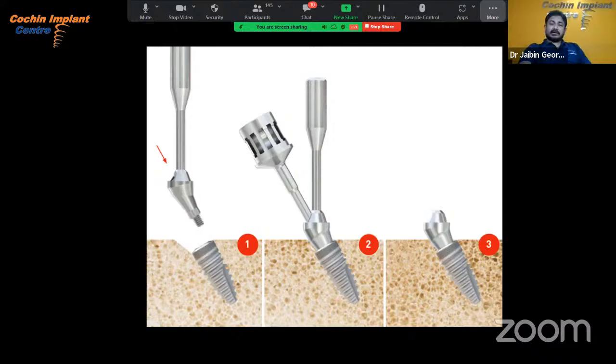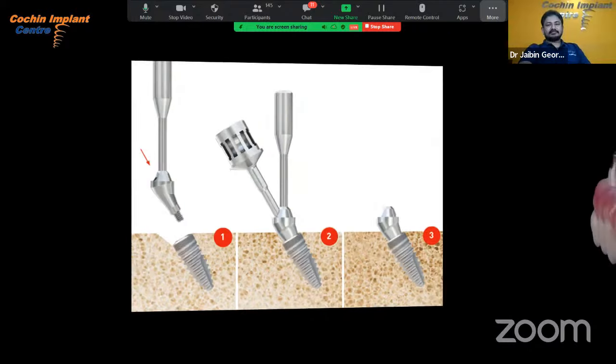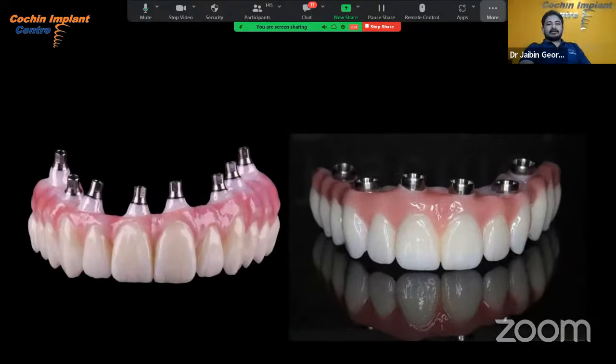We get nice soft tissue healing. We are not disturbing the tissue after the placement of the implant. You see, this process is without a multi-unit abutment. On the right side, what you see is with the multi-unit abutment.